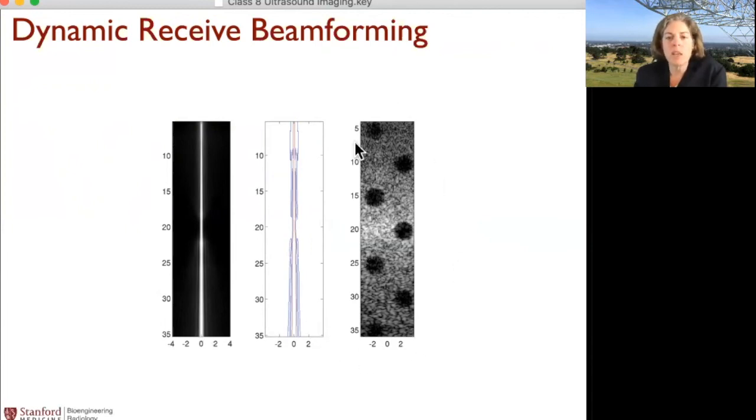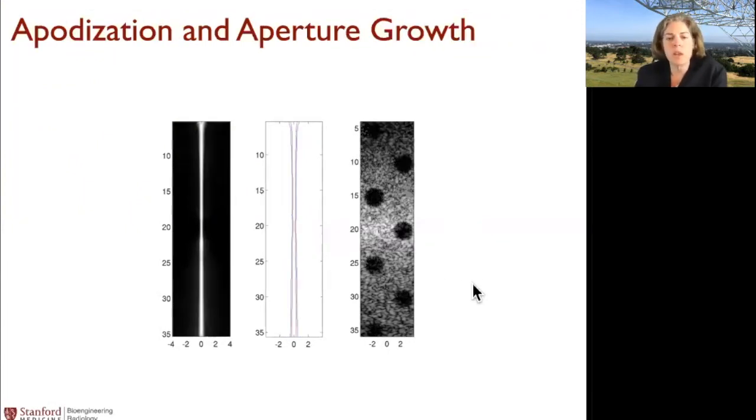And now you can see that you have a much better image, in that you can actually see structures that you weren't able to see before. Maybe you combine that also with the weighting function and so on. So maybe it gets a little bit better.